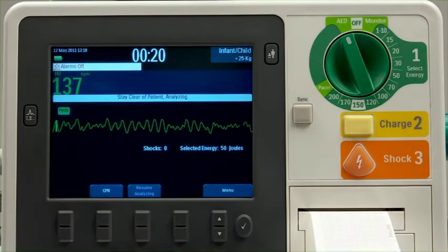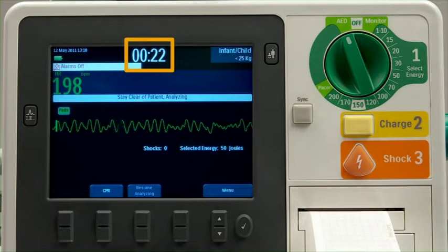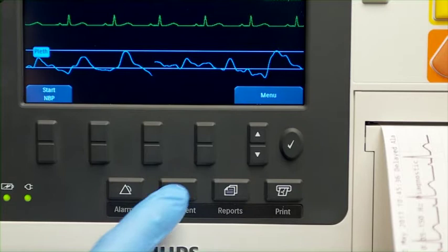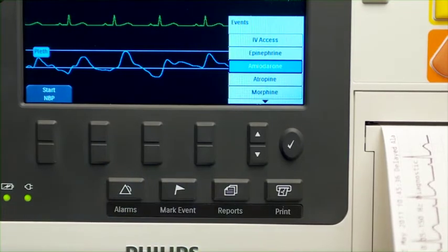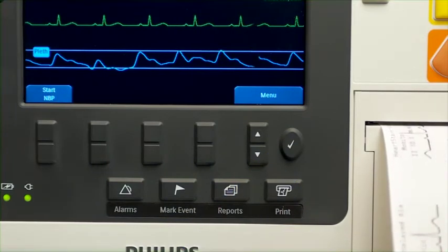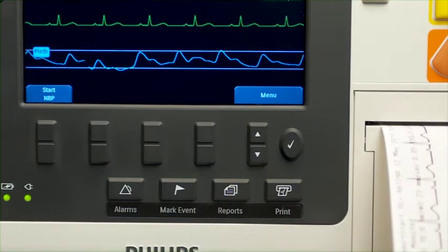The XL Plus also displays an event timer, which shows the elapsed time since turning on the device. Press the Mark Event button to insert a time-stamped annotation on the ECG strip and in the event summary report to document medication administration or a procedure.